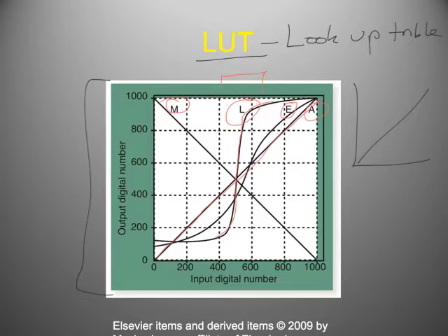You can see the film goes from completely white to something that's almost starting to get burned out, right? Then he did the same techniques, or similar changes in techniques, with a computed system. Nothing changed, right? That is really the power of computed radiography, that as long as you're sending a signal, it can receive it, right?